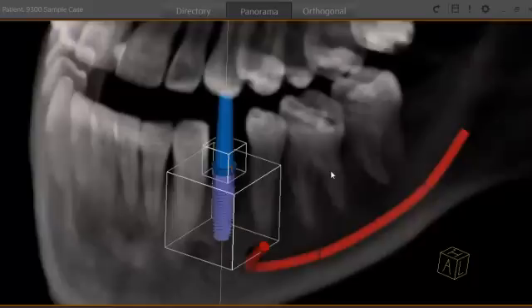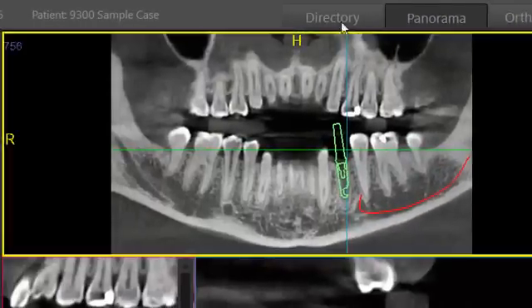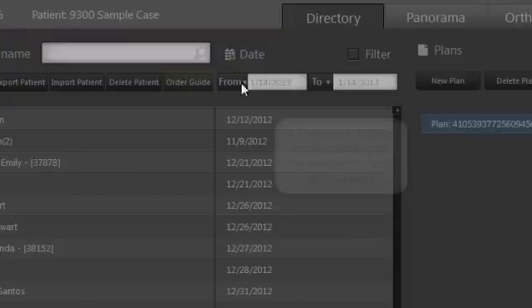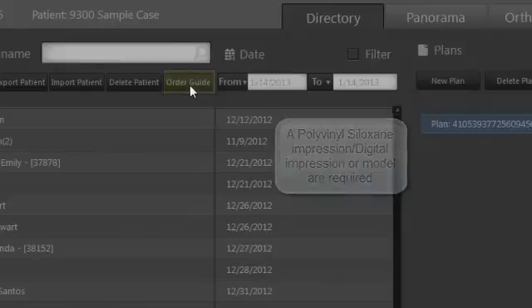Once you're finished, it's very simple. You just come up here to the save button, move over to the directory, and click on the order guide tab. What this does is portal the entire treatment plan over to our lab where they will then be able to print out your guide.